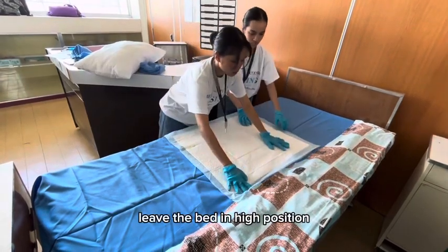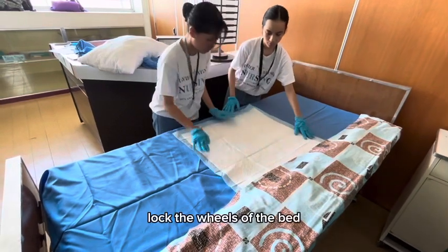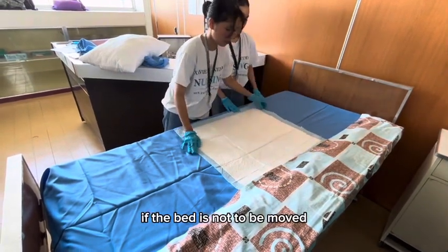Leave the bed in high position with the side rails down. Lock the wheels of the bed if the bed is not to be moved.